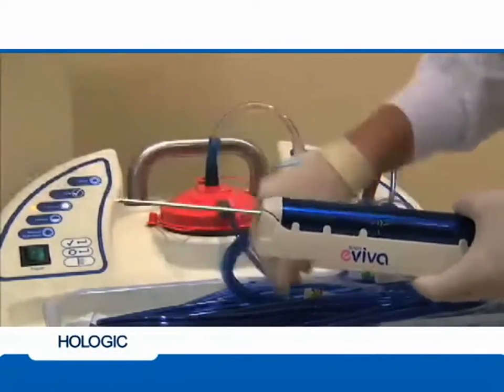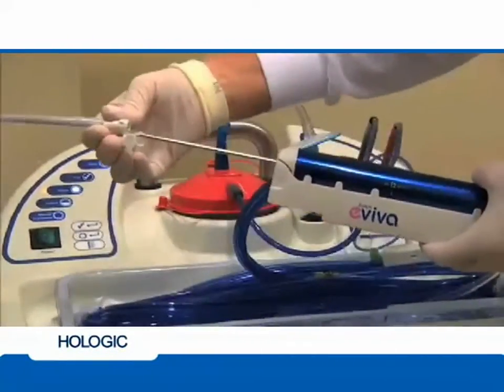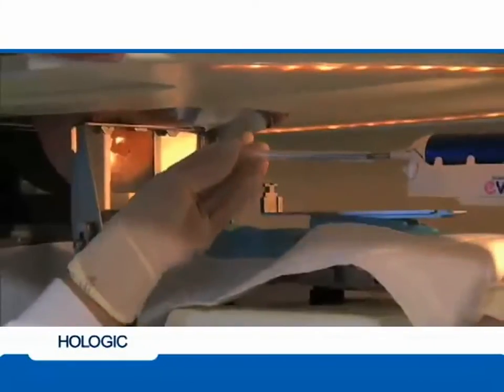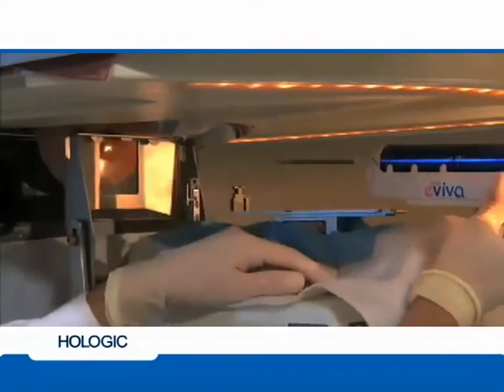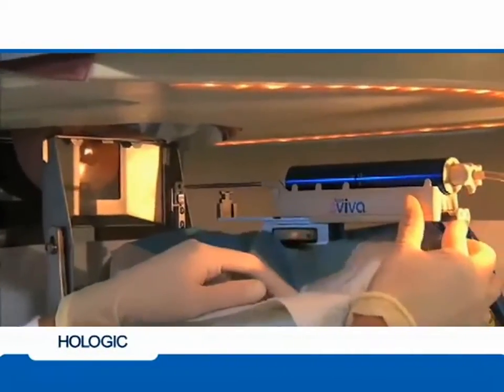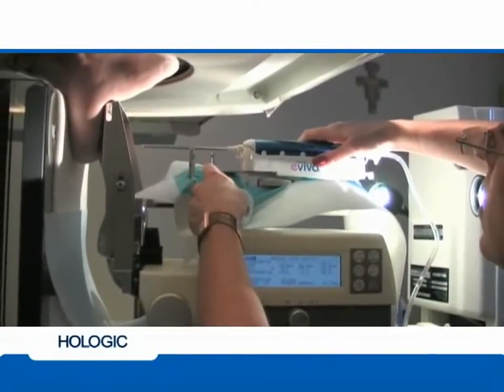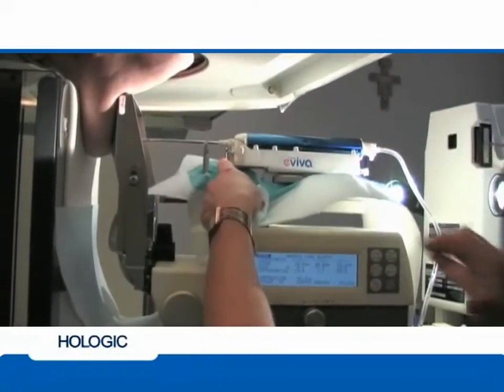Remove the protective sheath from the biopsy device and assemble the introducer onto the device, leaving the protective sheath on the introducer. Before putting the device on the adapter, remove the sheath from the introducer and confirm the device is in the pre-fire position with the white button on the firing mechanism fully depressed. The Eviva device is placed into the adapter, sliding the needle through the needle guide and locked into place at both the front and back of the adapter.